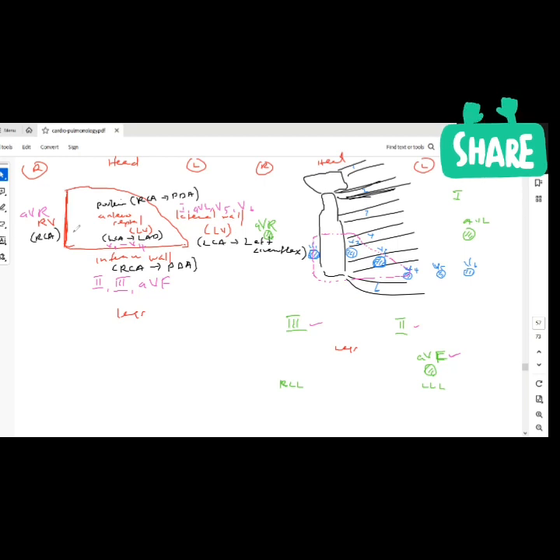Inferior wall, as well as the right ventricle, right? So if I see an inferior wall MI, I can predict that our patient also has posterior wall involvement, because it's the same artery that supplies both of them. And the right ventricle too. Does that make sense? Good.